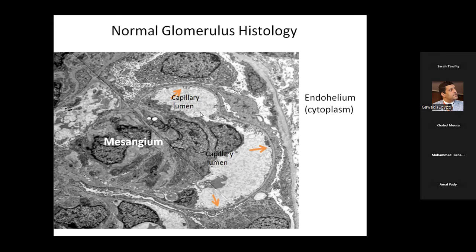It may be that the first site where the immune complex deposits go is the mesangium, before going to the subendothelium, because this area is in direct contact with the bloodstream. And that's why mesangial deposits cause hematuria, right? Actually, I don't know. I didn't read about this pathogenesis before.